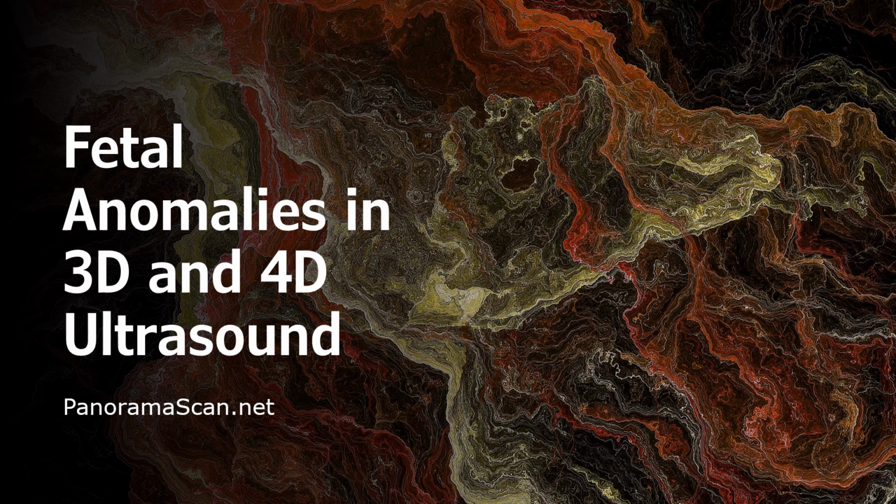Today, we will explore the fascinating role of 3D and 4D ultrasound in identifying and assessing fetal anomalies. This advanced technology has revolutionized how we approach prenatal care, offering incredible insights and improving outcomes for families and their unborn babies.